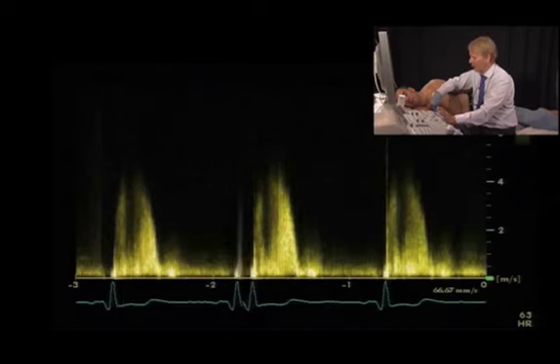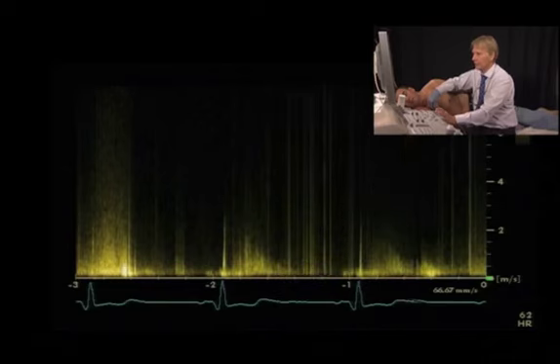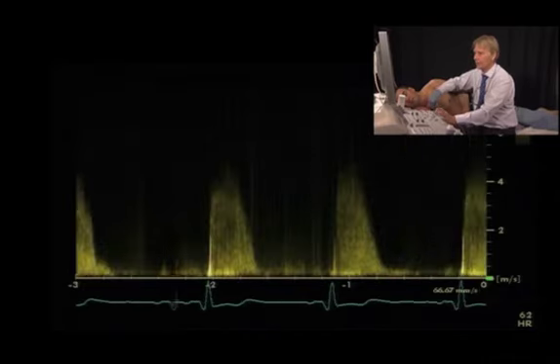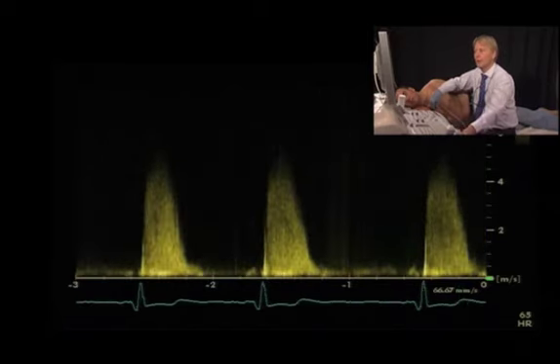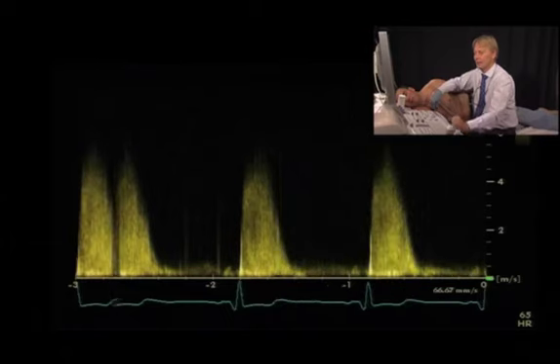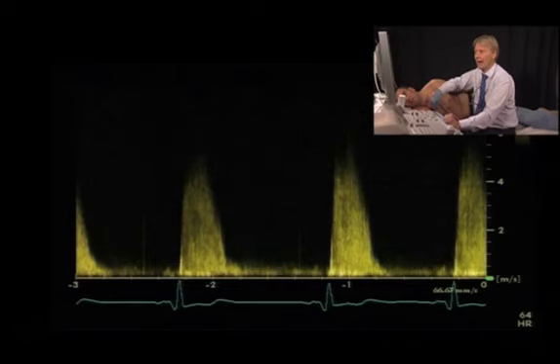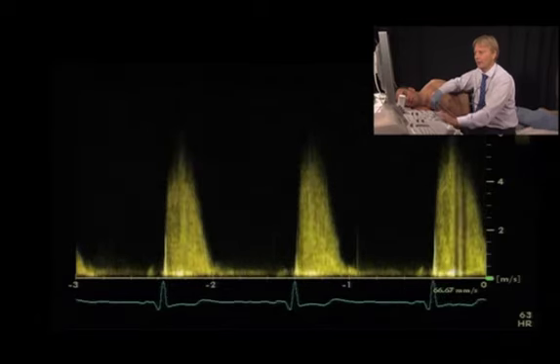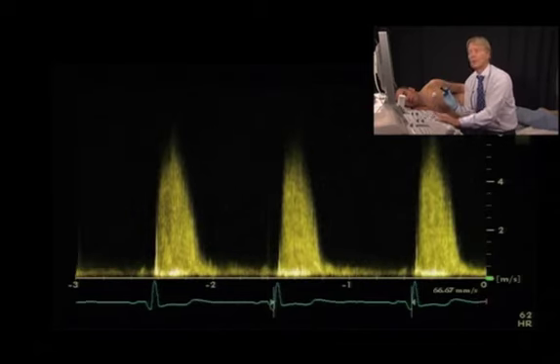So I will now move more cranial with my transducer position, and again adjust the transducer. It's very important to also listen to the signal, because this gives you more information where you actually are than sometimes just looking at the image. And here you can see that the maximum velocity is now higher than what we had before. And here we have a signal now which is almost 6 meters.